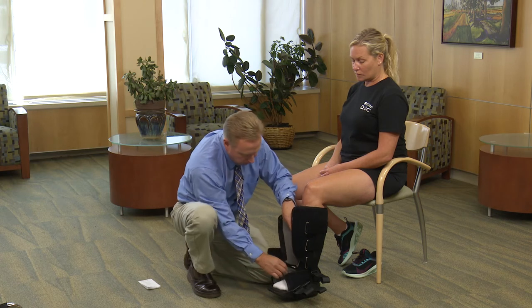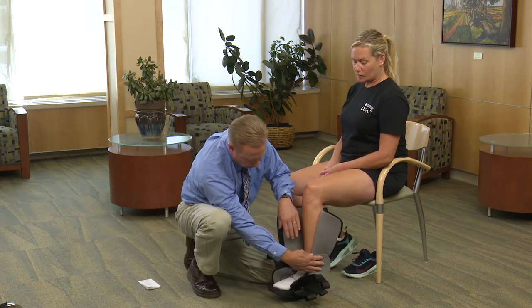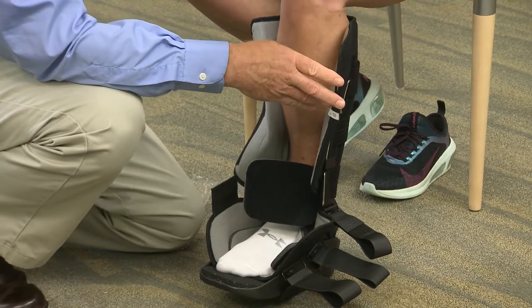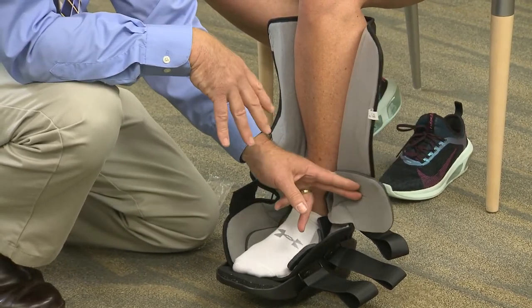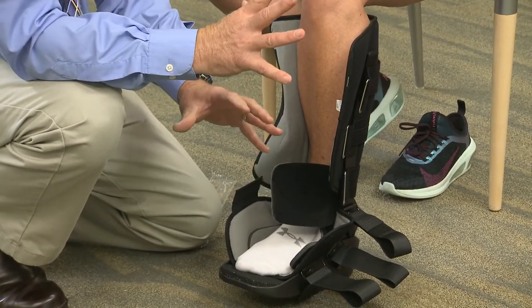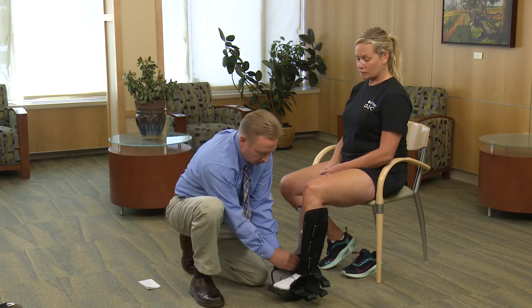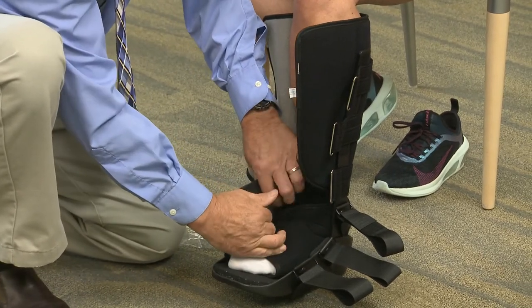So now your boot is open, your foot is exposed, and you're out of the boot. There's no messing with the metal stays that we originally put on — it's strictly undoing those straps and coming out of your boot. When you go back in your boot, make sure your heel is all the way back where it should have been in the first place. Tuck this tongue back in and it's just reverse of what you did.